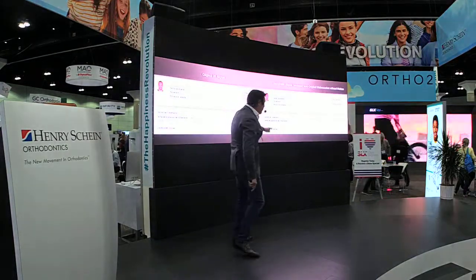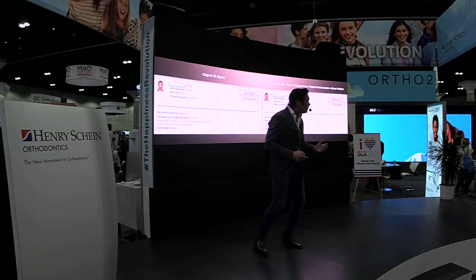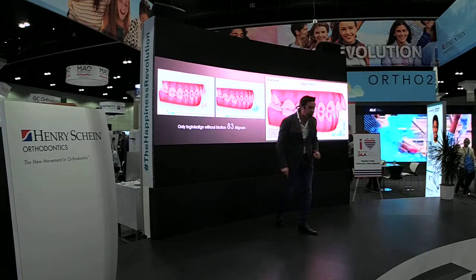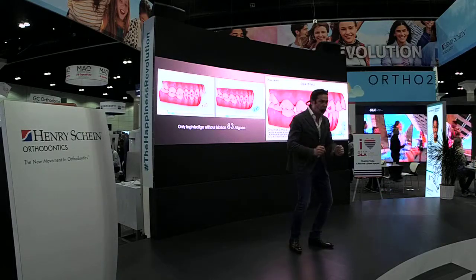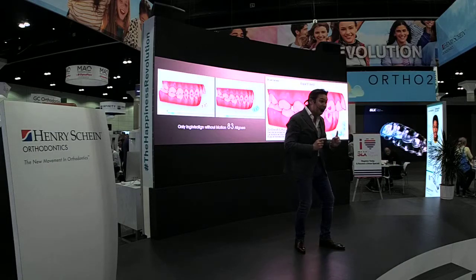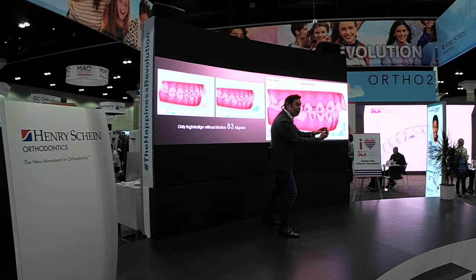But we did an experiment. We submitted the case to Invisalign again from scratch with the class 2. And what happened with that? At this point, we received an option to treat them only with aligners, with 83 aligners. So imagine, instead of 28 aligners, we were having an option of only Invisalign, only aligners, of 83 aligners. And amazingly, this option was only focusing on distalization, was not inviting the mandible to be repositioned forward.